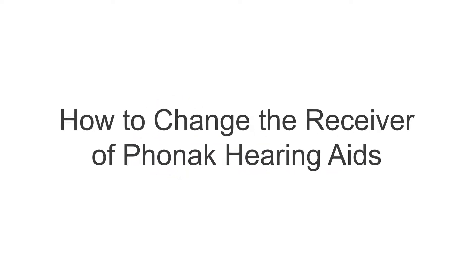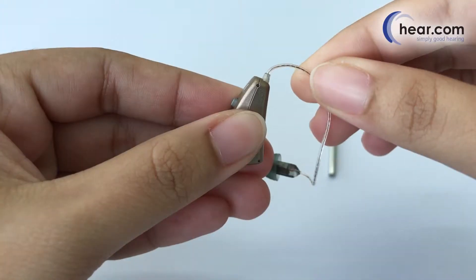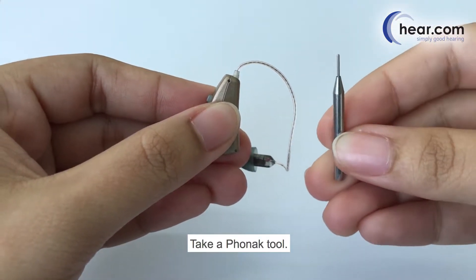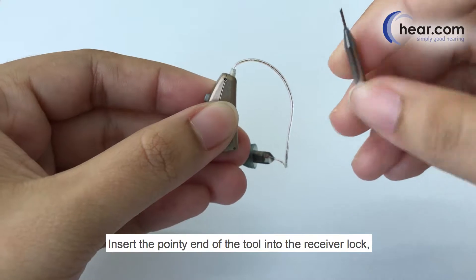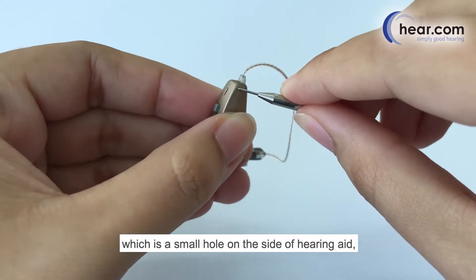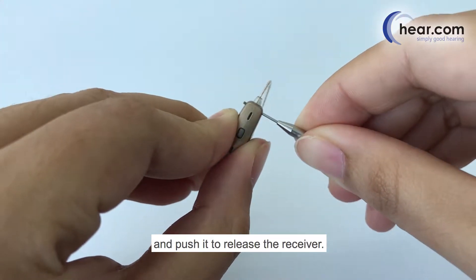How to change the receiver of Phonak hearing aids. Take the Phonak hearing aid and a Phonak tool. Insert the pointy end of the tool into the receiver lock, which is a small hole on the side of the hearing aid, and push it to release the receiver.